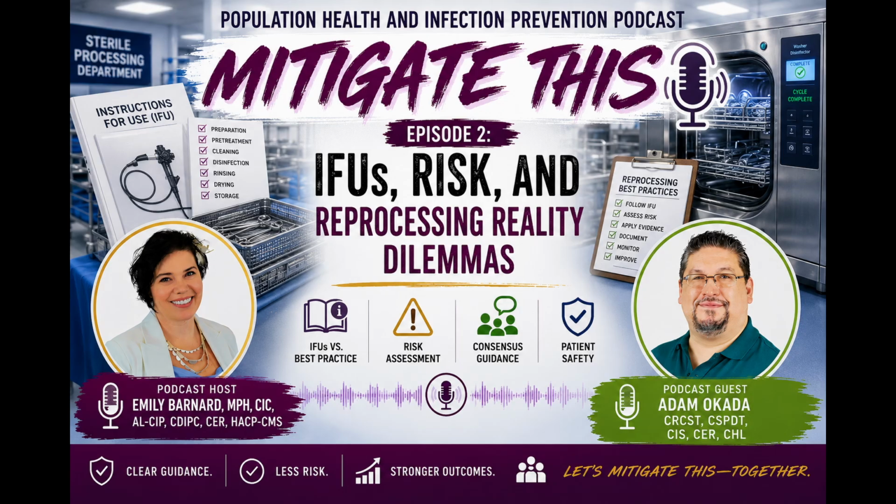The challenge is that sometimes these recommendations, especially within AAMI technical information reports, also known as TIRs, can go beyond, even appear to conflict with, the manufacturer's instructions for use. So how would you navigate that gray space when consensus guidelines are aiming for best practice, but the IFUs don't quite align? How should organizations approach risk assessments, decision making, and accountability without drifting outside compliance boundaries, especially as established by the Joint Commission hierarchical approach?